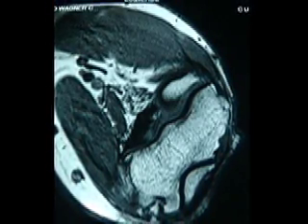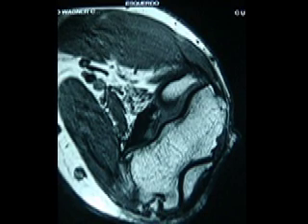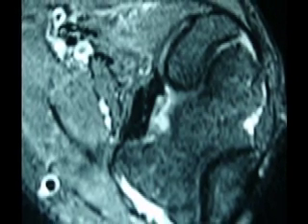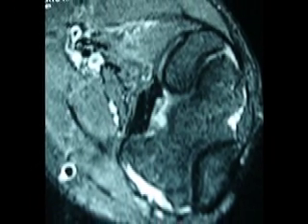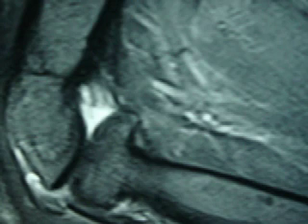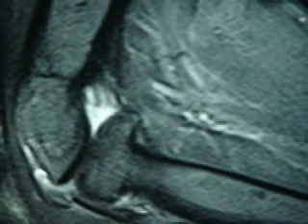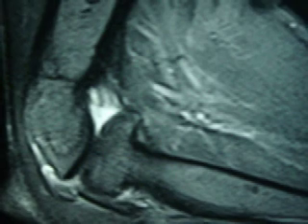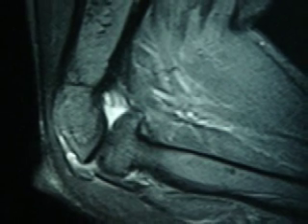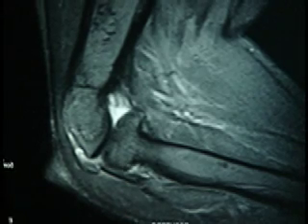In this image, we can see that the distal humerus cartilage was incredibly intact. And in this image, we can see that not only the distal humerus cartilage was in nice shape, but the radial head cartilage was in good shape too. In the lateral view, still in the MRI, it's very clear that the radial head was definitely deformed and that the anterior capsule was intensely retracted. After discussing this case with a lot of care, we decided to perform an arthroscopic release of this left elbow.